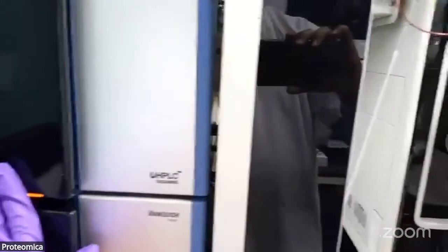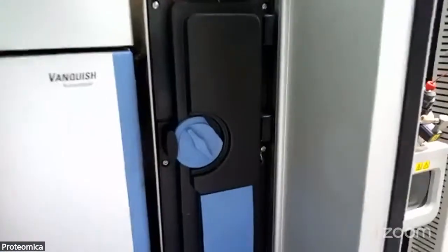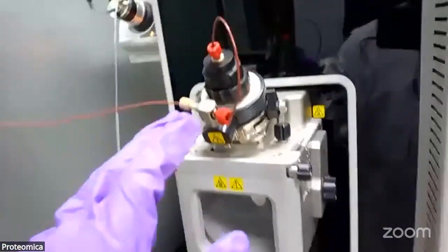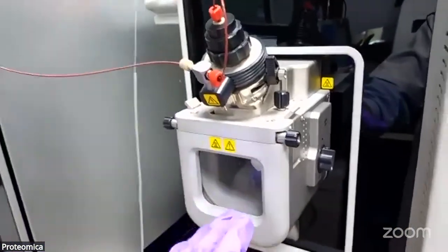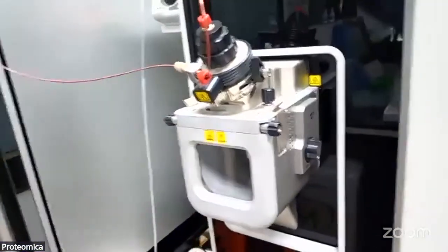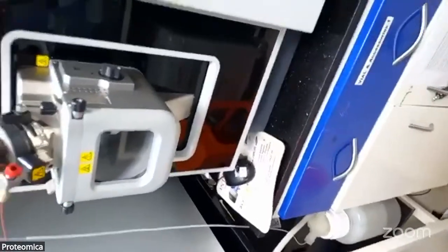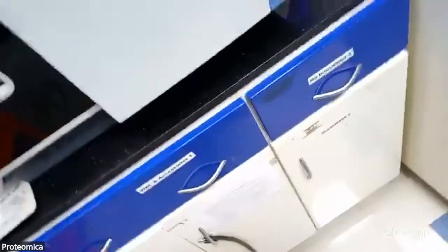Once you place your samples inside, with the pumps the samples are getting eluted. From the sample elution, it directly comes to the column compartment. So this is the column compartment, and once the samples get inside, it directly goes to the source where the samples are now being eluted. And once the sample is eluted, you can find the SRM and PRM based applications, which can be routinely used. So back to you, Prof, for the introduction of the timsTOF.